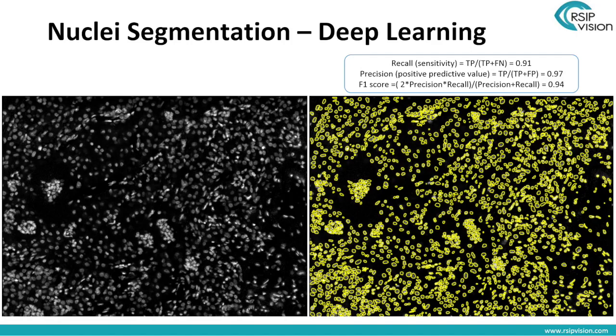The way to do this, so there's a parameter here. You need to define some tolerance. You're not going to detect each and every cell at the same central pixel as the ground truth cell, but you can define some reasonable tolerance. You can measure afterwards how well your results have obeyed this tolerance, and then you count how many cells of the ground truth have I detected, say, to within 1 or 2 or 3 pixels, how many cells that the network has detected are being missed, and then you get your precision and recall numbers.